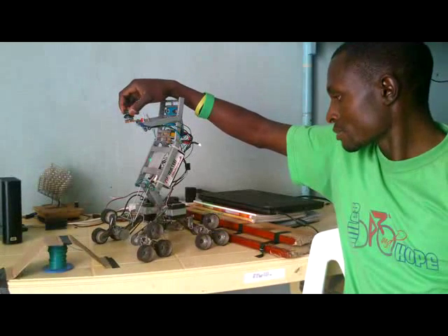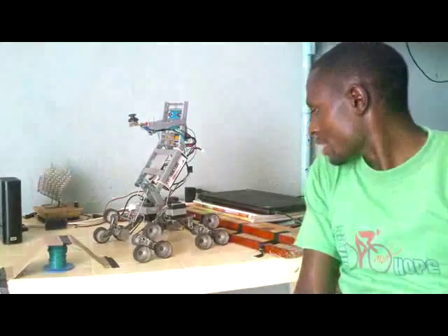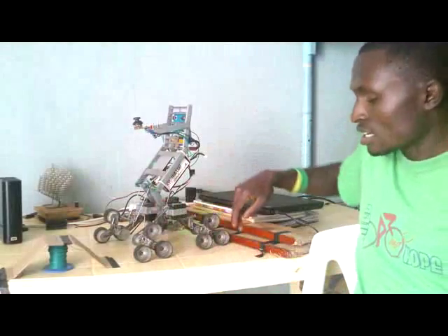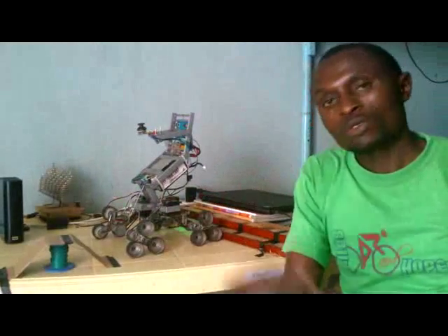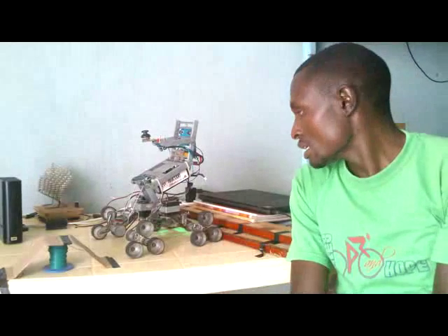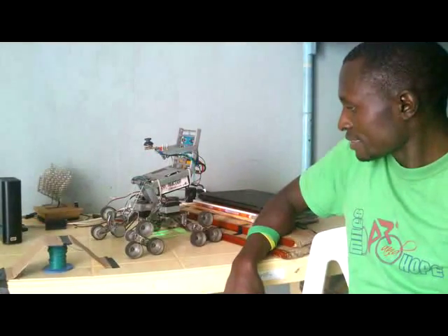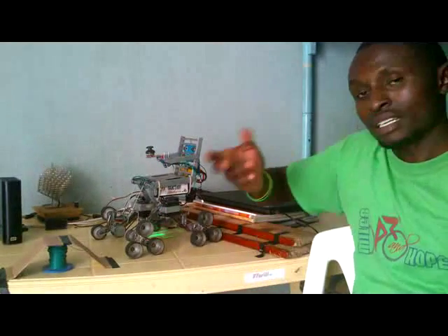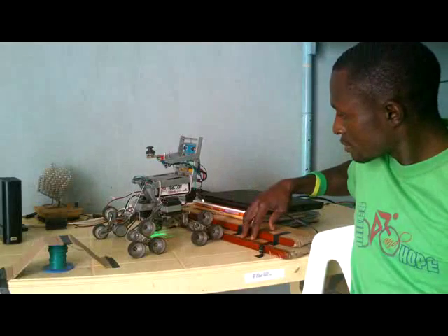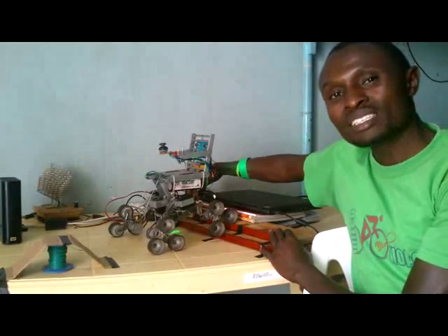Now I'll just make it move to its normal sitting position, and then I will show you how it will go upstairs. Now these are just 4 sets of stairs, so I'll just show you in a minute. Just position it. So for this prototype specifically, it has only one gear to move forward and reverse, and you will notice that it's very slow because of the gears that I had. Slow but sure. Now I will enable it to move in reverse. Let me just hold these stairs of mine, they are not that stable. You can notice the seat is auto adjusting.